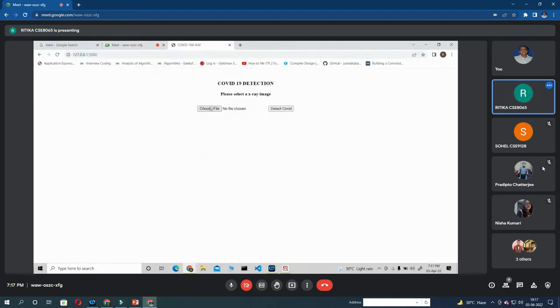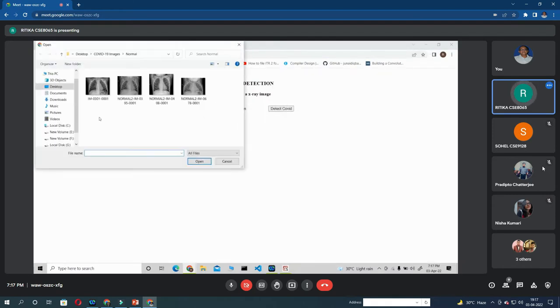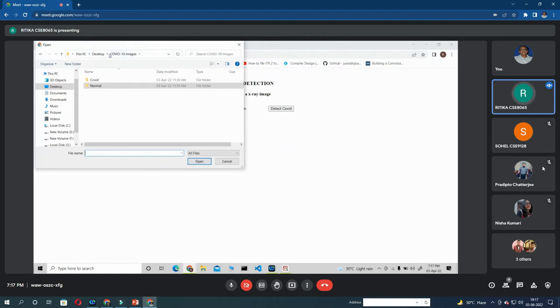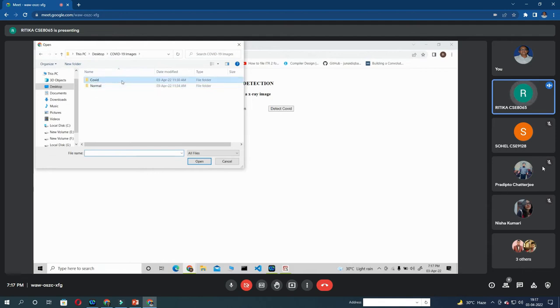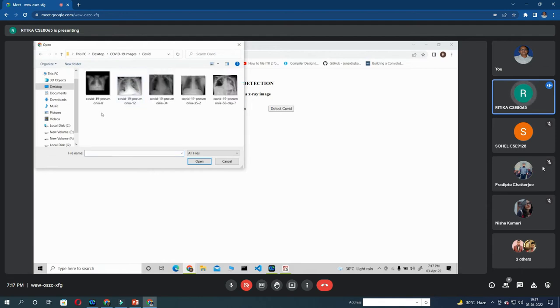From here we have to choose the file. I have already made the folder. One is of COVID positive and another one is of normal. Suppose I am selecting an image from COVID folder.